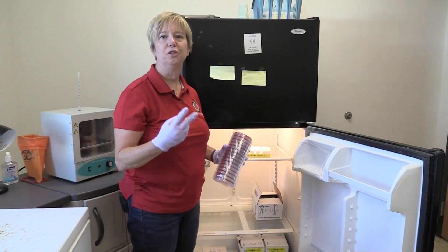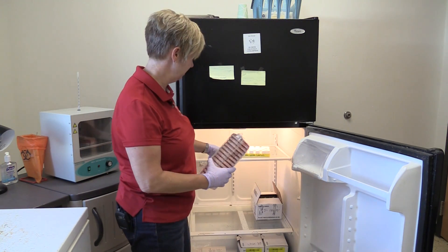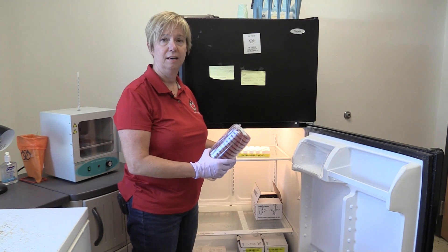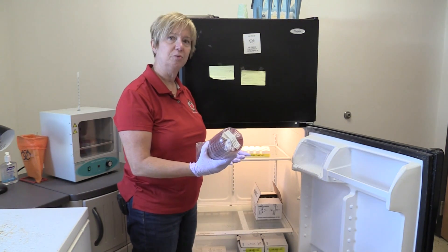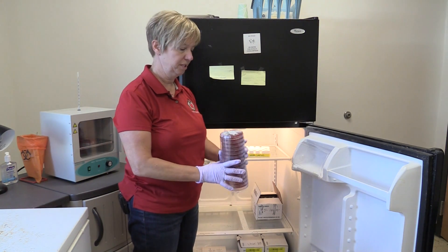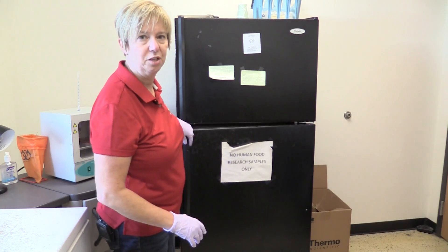There are really two key pieces of equipment to consider when doing an on-farm culturing program. One is simply having a clean refrigerator that's not used for storage of food for human consumption. We need a place within that refrigerator where we can store the on-farm culture media. You'll see that these are sealed and we've got a great place where we can keep these when we're not using them.